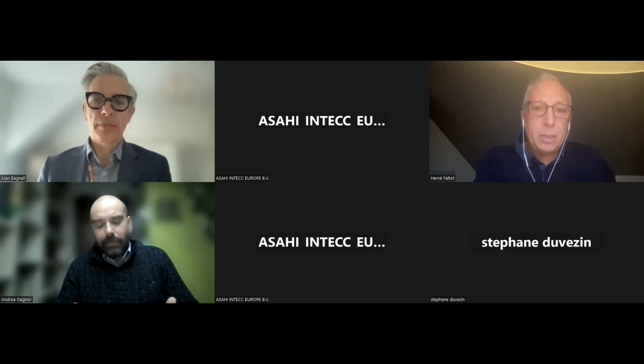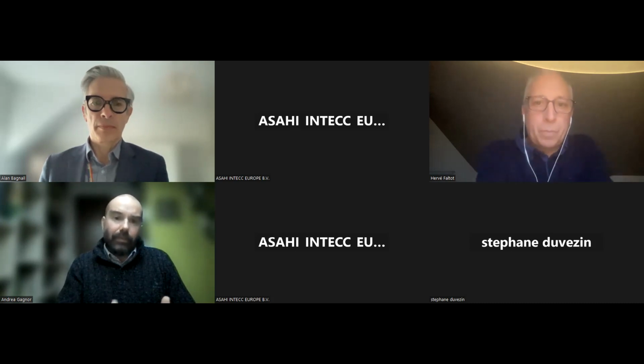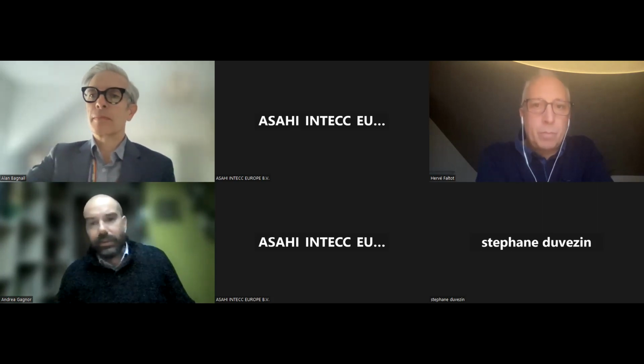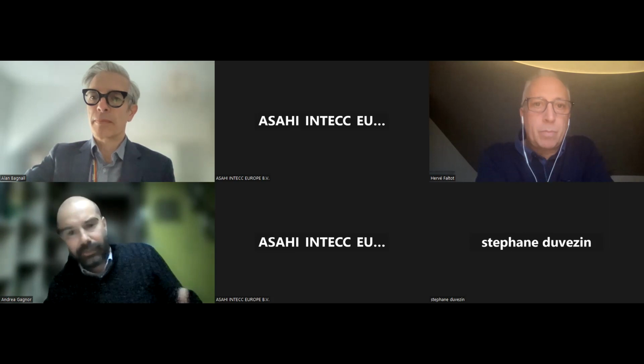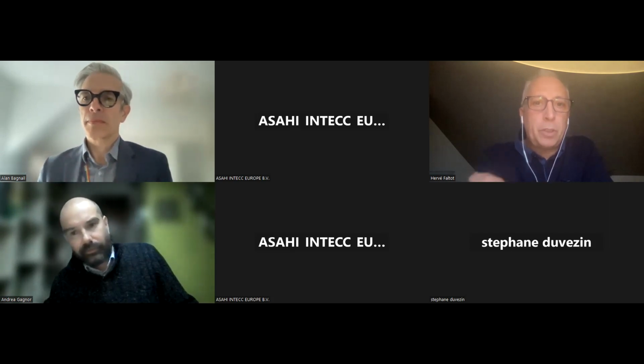In that case, probably I can use something like Gaia Second in order to be redirected, or something polymeric like Gladius. If I want to re-enter from the antegrade approach into the distal lumen, maybe I can use a stiffer wire, Confianza Pro 12, maybe even something different, but something very stiff and very penetrating, for the puncture.